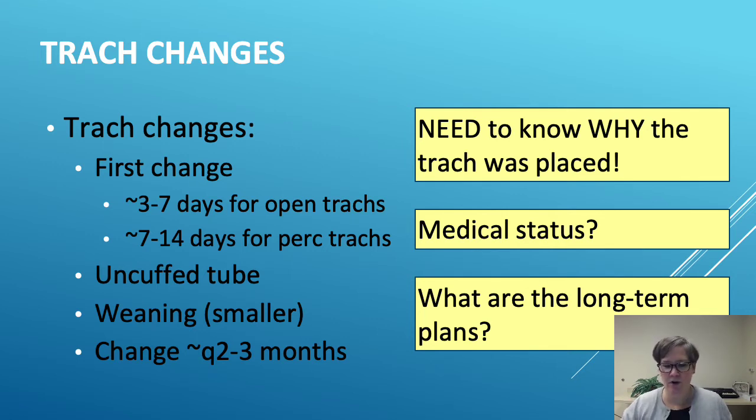And in long-term trach patients, the question becomes, well, how often should we change the tubes? And again, there's no good answer to that, so it's really up to your clinical judgment. I'll tell you that plastic and silicone tubes do develop a biofilm, and that can lead to stoma, stomal tract, and tracheal wall irritation. They can also start to smell a little bit. So patients will sometimes describe the sequelae of this as pain or increased phlegm or secretions. And frankly, if they're a smoker, the tubes just get really nasty, so they probably need to be changed more often.